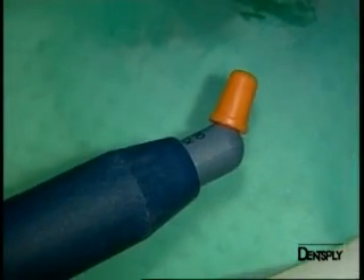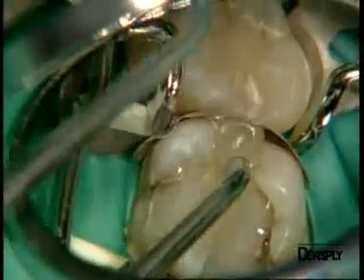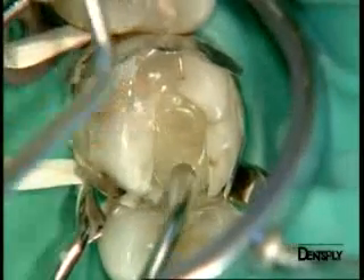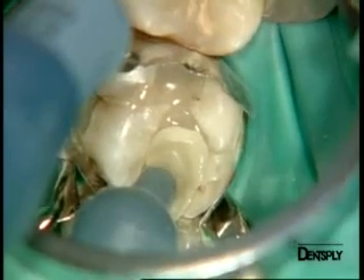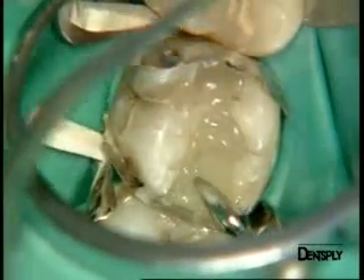Quicksfill posterior restorative will be used to complete the entire occlusal filling and will require only very few steps to fill the whole cavity, due to the fact that this material can be polymerized in deep layers up to 4 mm at once, cured in 10 seconds. The composite is spread out using a condenser and the final increment will be used to shape the occlusal surface. As you can see, the material never sticks to the instruments, which makes placement a lot easier and faster.